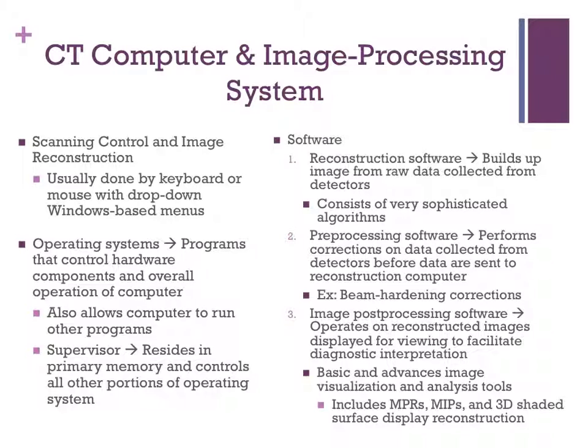Then there is image post-processing software. This operates on reconstructed images displayed for viewing to facilitate diagnostic interpretation. This software can be placed in two categories: basic and advanced image visualization and analysis tools, which include MPRs, MIPs, and 3D shaded surface display reconstruction.